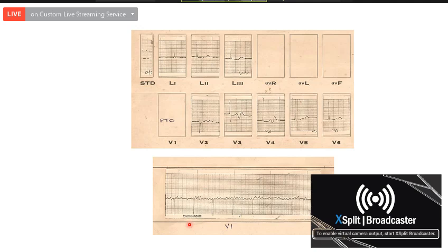And what else, besides complete heart block and atrial fibrillation? Any chamber hypertrophy? No, sir. In V4 the R wave is almost 25, 23 divisions.